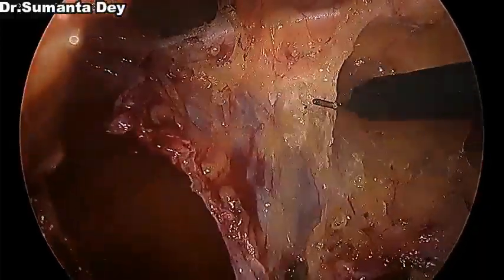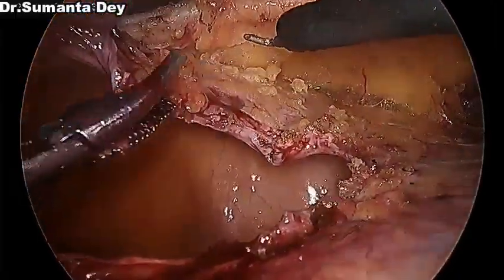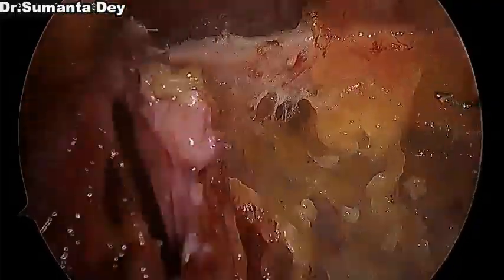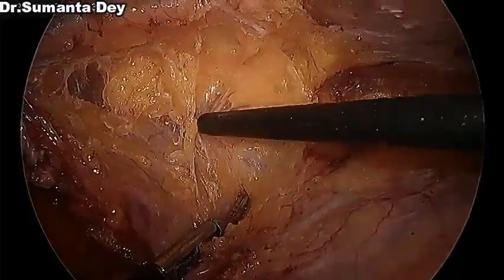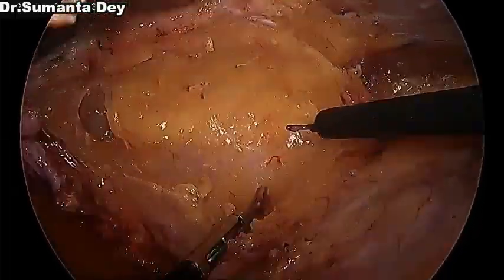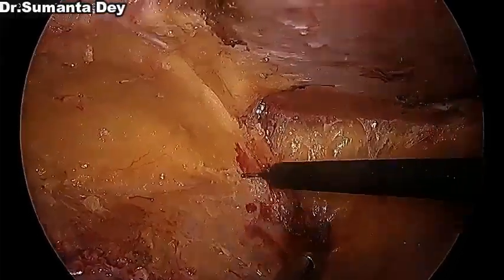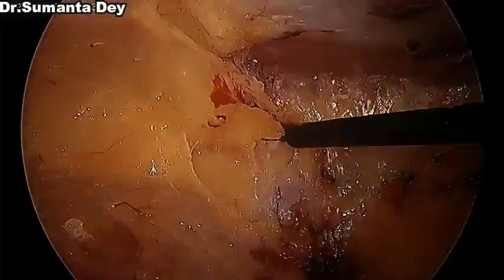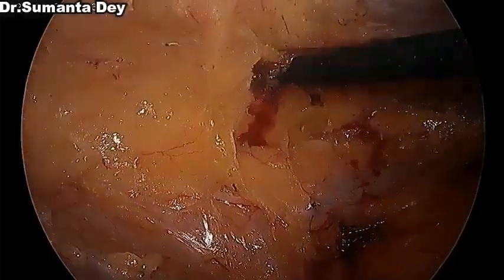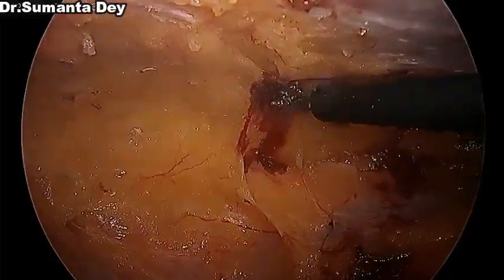So you can see now I have lifted up the peritoneum, and now I'm going beyond the hernial defect margin on the opposite side. So this is the distal border of the hernial defect, and now I am separating the preperitoneal fat from the lateral abdominal wall fat and mobilizing the peritoneal flap on the opposite aspect. You can see that almost all the dissection I have done in this case with the monopolar cautery.